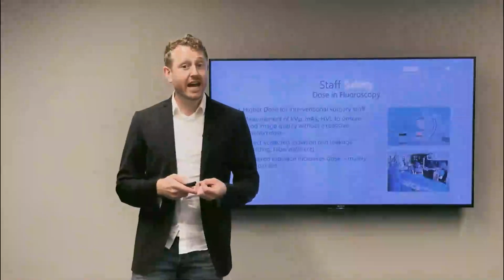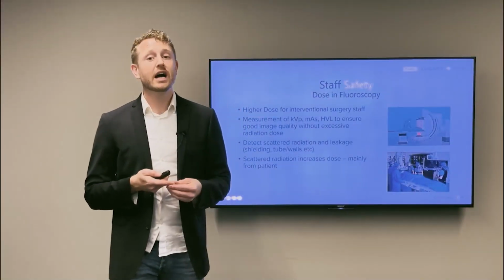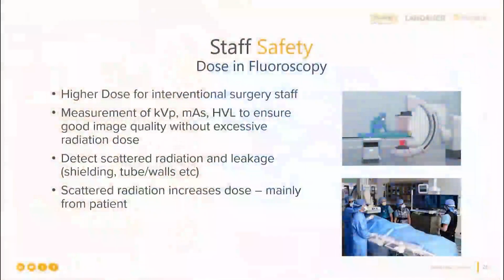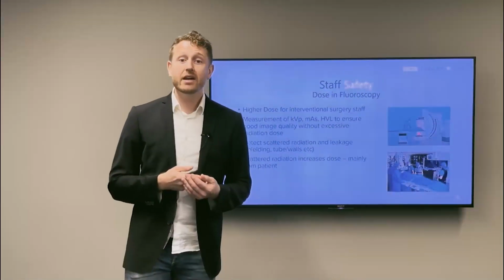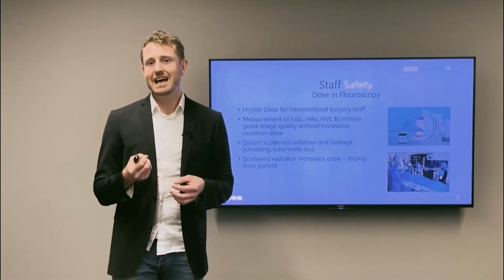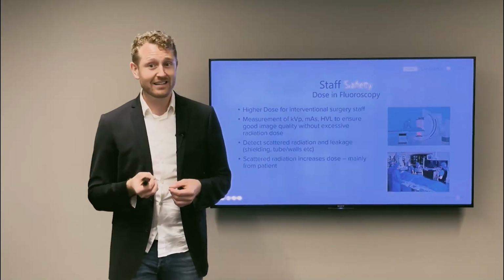A special type of X-ray modality where staff is exposed to high doses is fluoroscopy. Fluoroscopy is a technique mainly used during surgeries, for example, during heart surgeries. The surgeon may insert an instrument in a major blood vessel, guiding the instrument up to the heart via the blood vessel. But to be able to do this, the surgeon must know where the instrument is. By having a pulsed exposure with a high frequency, one can follow what's happening inside the body in real time.